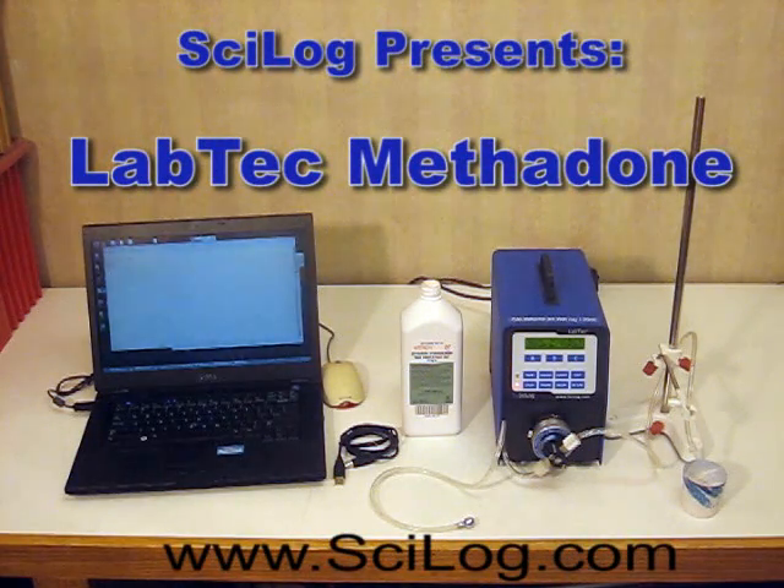Good morning. This is Douglas Johnson, product manager at SciLog Incorporated. Today I will demonstrate how to set up and use the LabTec Methadone system.